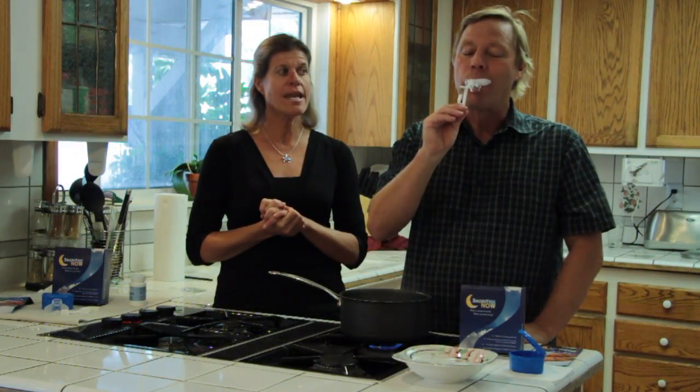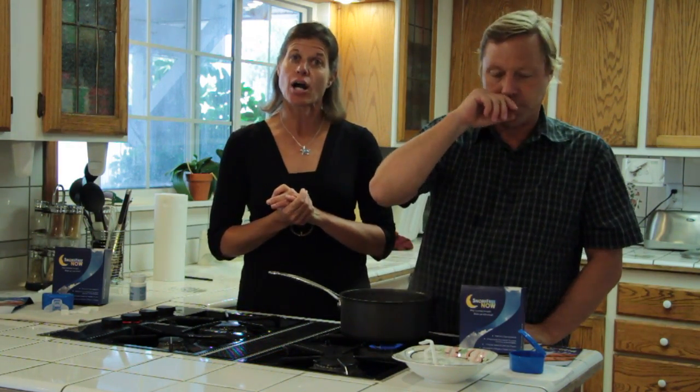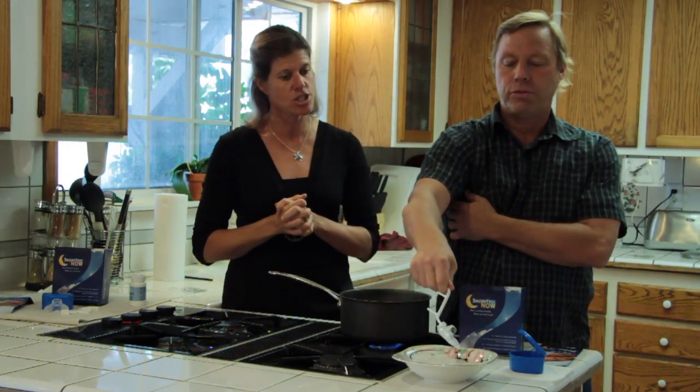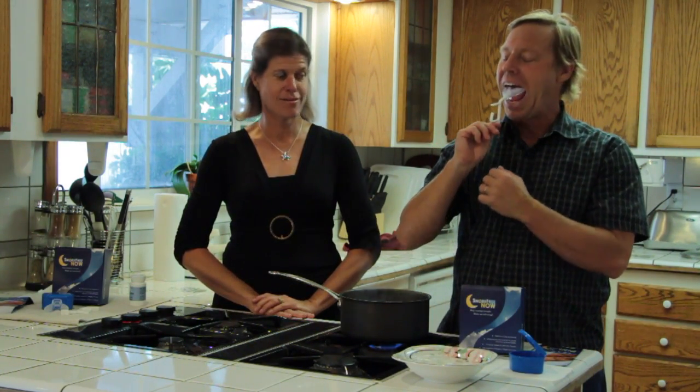Once that comes out, now it's very important. 30 seconds in here, 30 seconds in the ice cold water. Let's give it a shot. So, we are done. Should we try it out? Let's do it. All right.